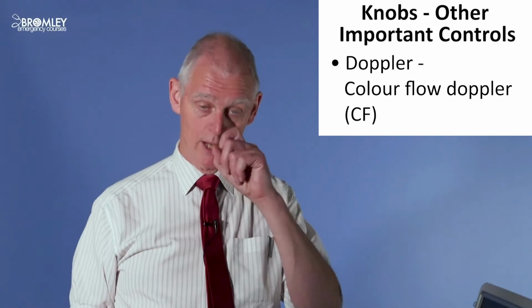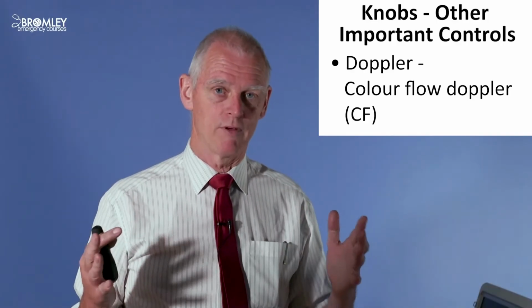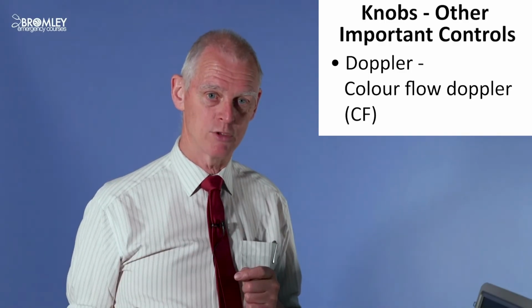It's the second of these functions that are useful to use from time to time. There are many different Doppler functions, and they're a huge part of modern ultrasound, and they have a great deal to add to ultrasound. So let's just think about the background to Doppler.